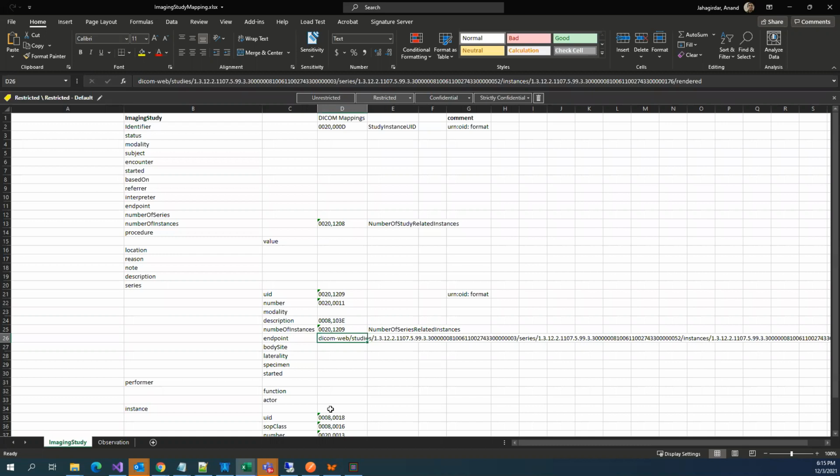And maybe on the .NET application side, where we want to query and pass it, there probably we can get some volunteers who would like to do it on the .NET side. If you want to do it on Node.js or JavaScript, I think we should be able to do it.